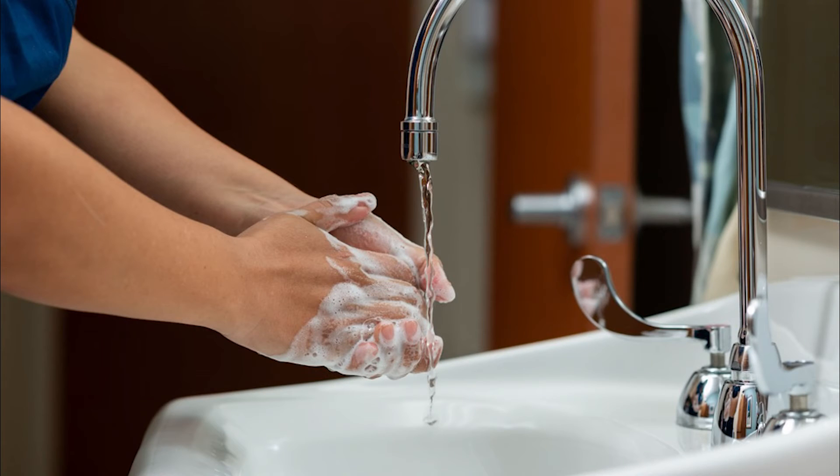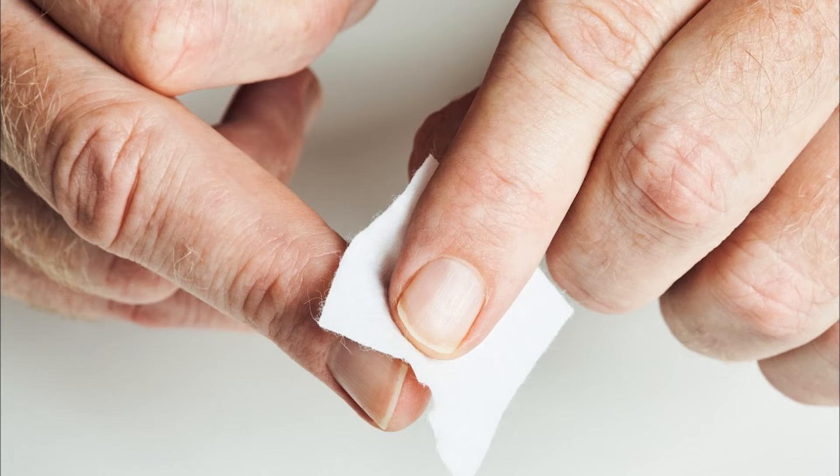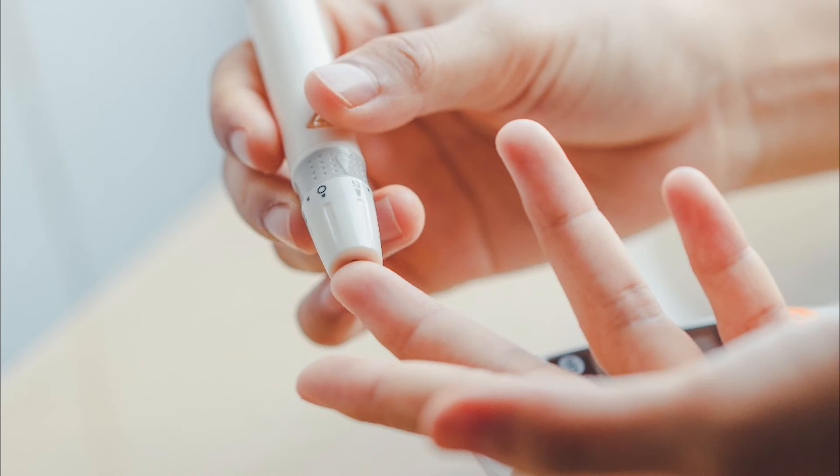Follow these steps when you are testing your blood sugar at home. Always wash your hands before testing your blood sugar — using warm water will make it easier to get a drop of blood to test. Clean your finger with an alcohol swab before pricking your finger, then prick your finger using the finger stick device and a new lancet.